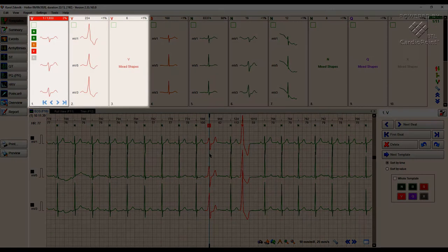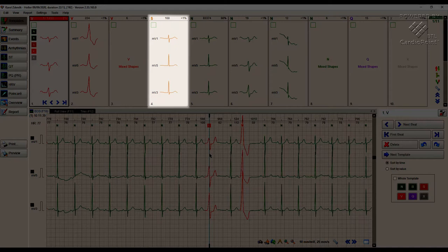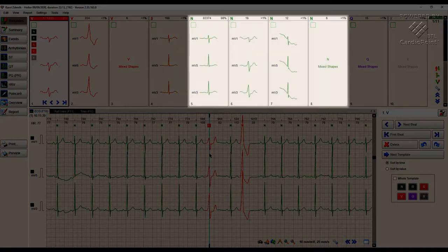Templates containing ventricular extrasystoles are shown first, then supraventricular extrasystoles, and normal complexes.